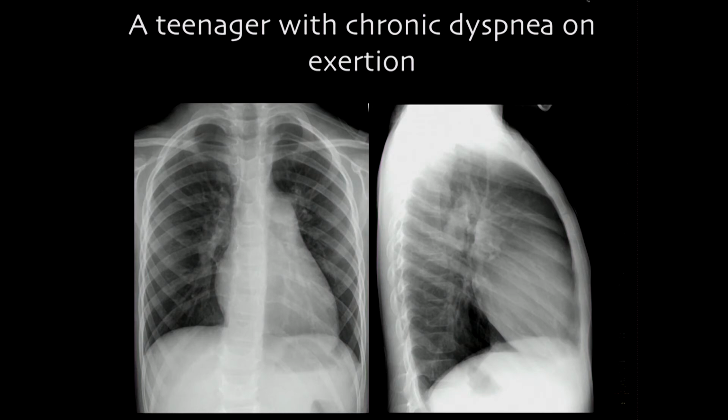One thing that I want to emphasize is that a lot of times people think that if you have right ventricular hypertrophy, you should have a round and elevated cardiac apex, because tetralogy of Fallot shows that finding. That's wrong. In atrial septal defect, in pulmonary hypertension, you never see an elevated round cardiac apex. This is a usual cardiac apex configuration. It's very similar to left ventricular enlargement. However, in lateral view, this posterior part is okay, but anteriorly, the retrosternal clear space is obliterated.